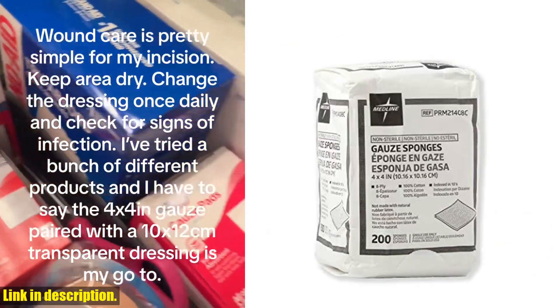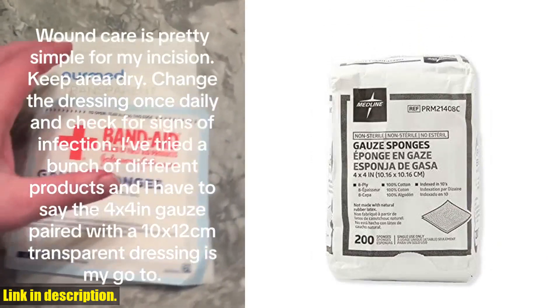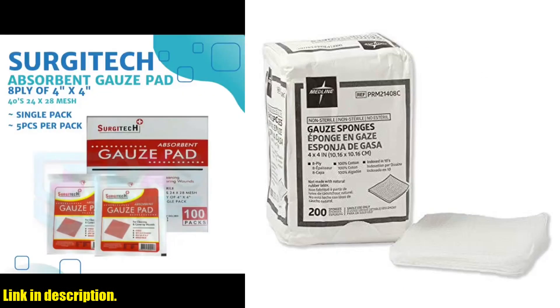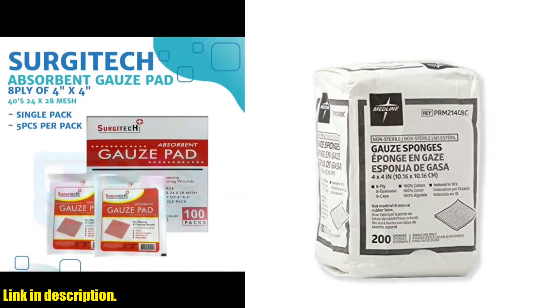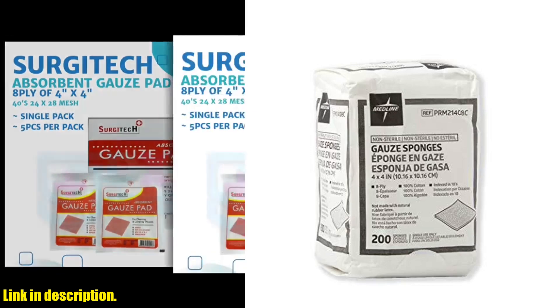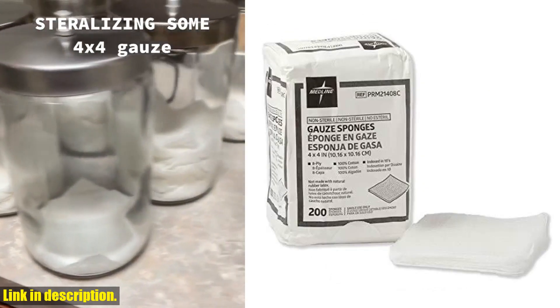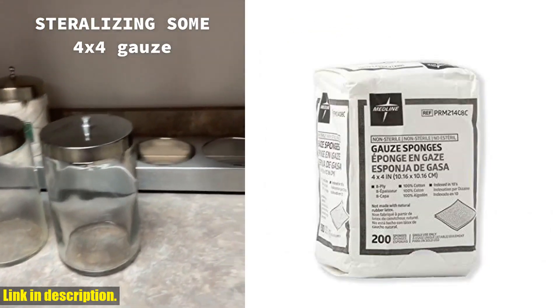First off, let's talk about the quality. These gauze sponges are made from 100% cotton and are woven to perfection, making them incredibly soft and gentle on the skin. They also come in an 8-ply design, ensuring maximum absorbency and durability. The C-fold design of these sponges helps to minimize loose threads and lint, which is crucial when it comes to wound care. The last thing you want is for loose fibers to get caught in a wound and cause further irritation.